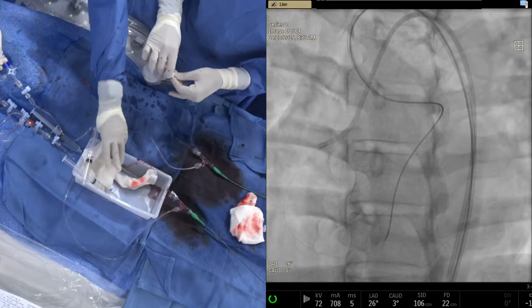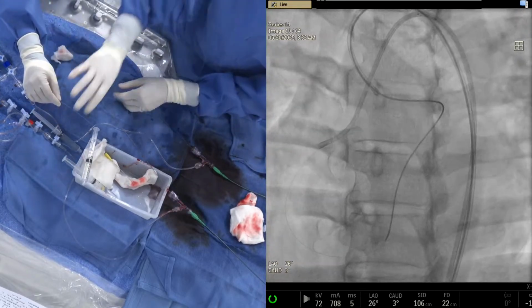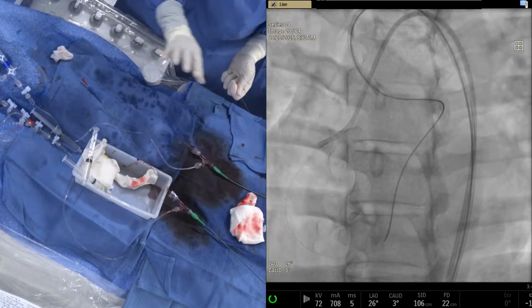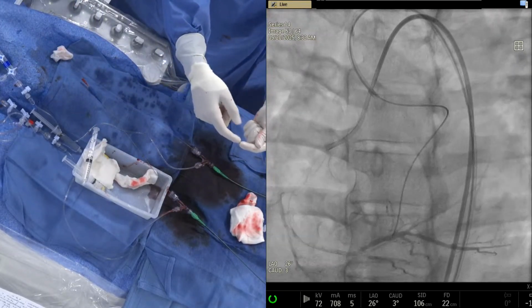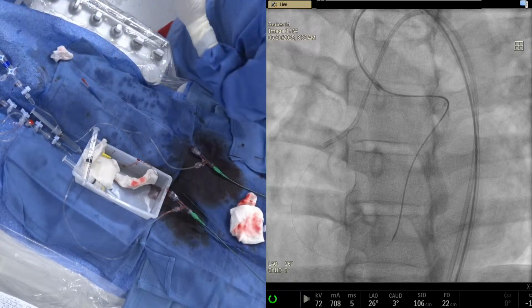What we normally like to do is use a fine cross antigrade, right? Which we did not do last time we showed. You go with the fine cross in the antigrade and you kiss the two and then you remove the wire. Do you have a fine cross? Okay, let's do that.